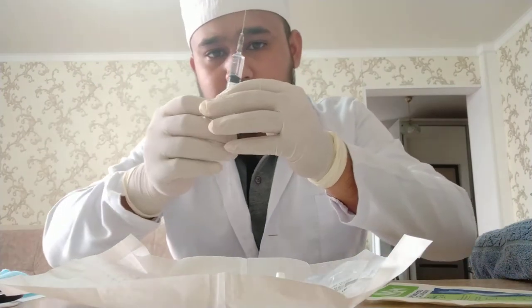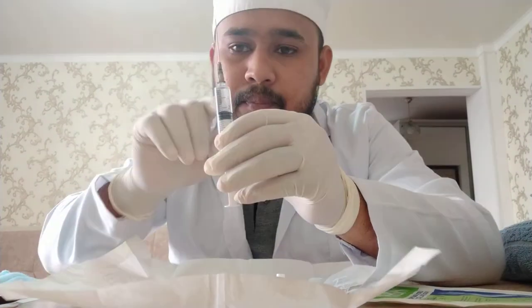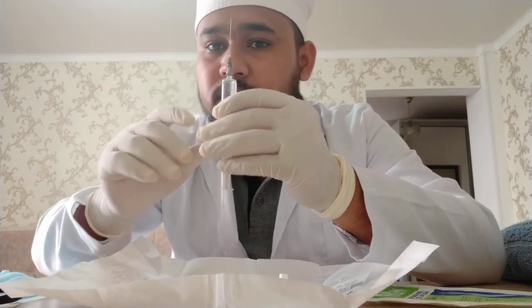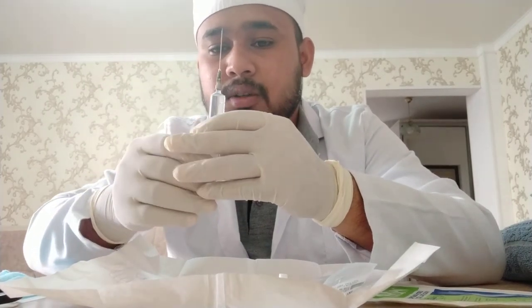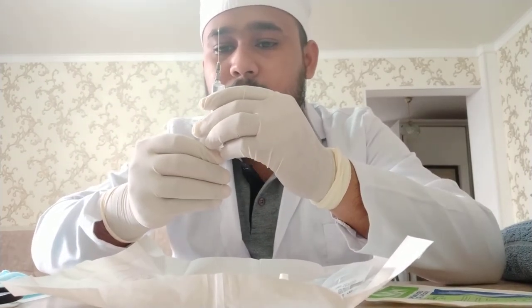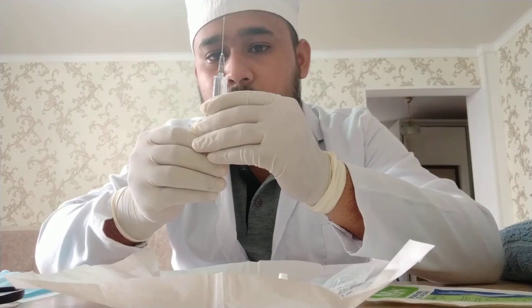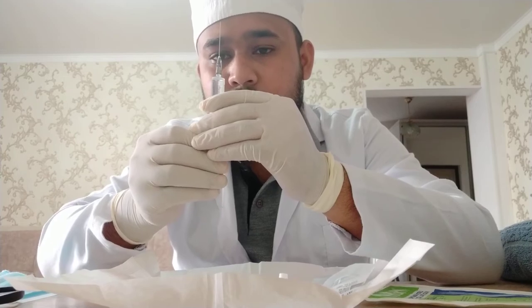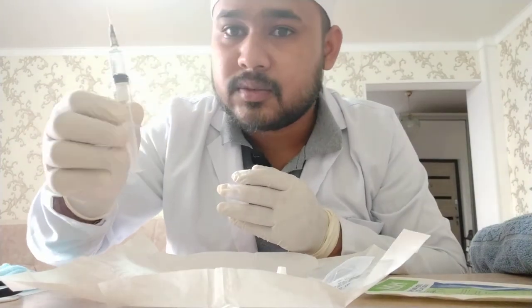Now you must be very careful about any bubble inside the syringe, because if this bubble is inserted into our vein, artery, or blood system, it may cause embolism. Embolism will lead to many pathological problems in our body. So you must ensure there is no gas bubble inside the syringe. All set — my syringe is free of gas bubble.